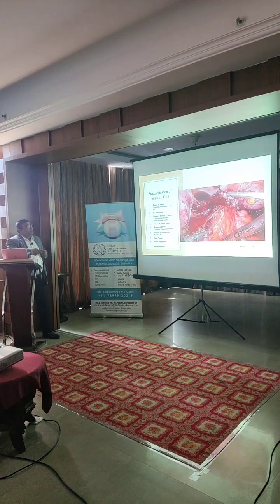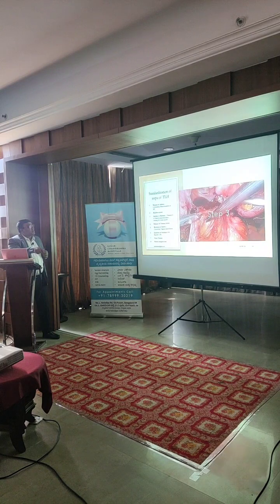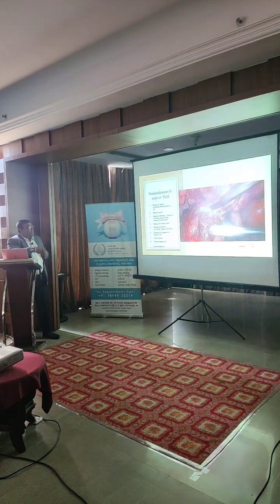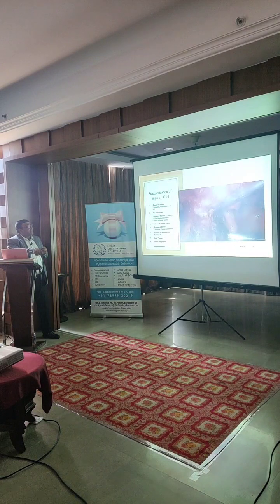Next is the UV fold. I have pushed the bladder. The next step is you can see the uterus here, and then the rectal nodule. So the rectum is actually stuck to the uterus. So the next step is to open the pararectal space, then start dissecting the nodule.